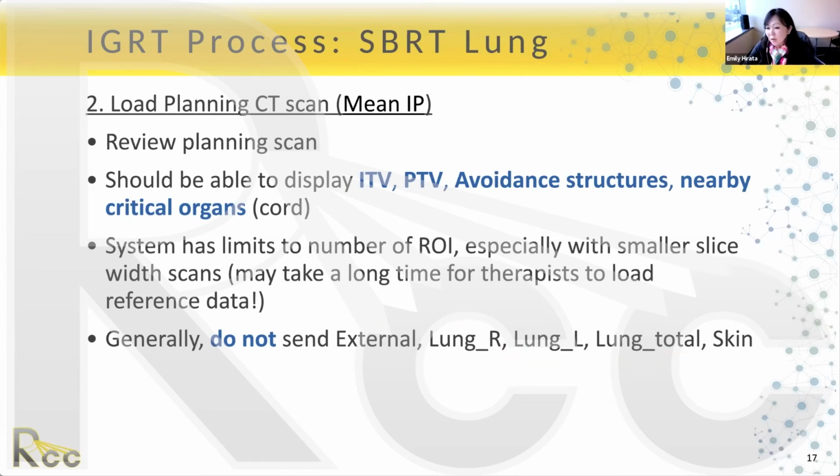And actually, I see a question about if you have a central lesion, would you recommend sending the heart PRV? Yeah, I think that would be good to do. And then another question about slice thickness. The slice thickness you get from 4D would be different from what you get in this cone beam. Does it make any difference in matching both images with respect to GTV?